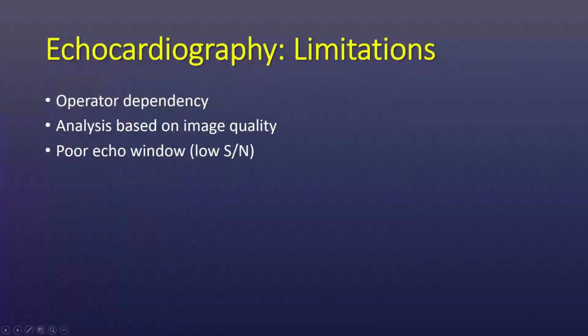So all good for echocardiography, yes, but there are, of course, and we all know, important limitations. First of all, operator dependency, and also all the analysis. We can use the most advanced software we have in our hands, but if the image quality is poor, we will just multiply errors. So it's extremely important to get good image quality. And the limit of echo is, as I said already, the low signal to noise contrast ratio.